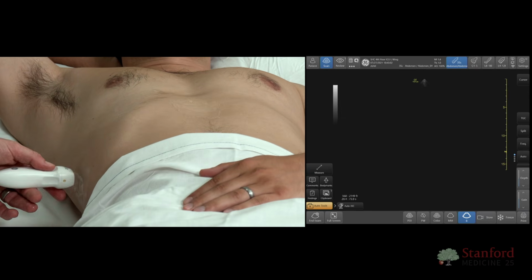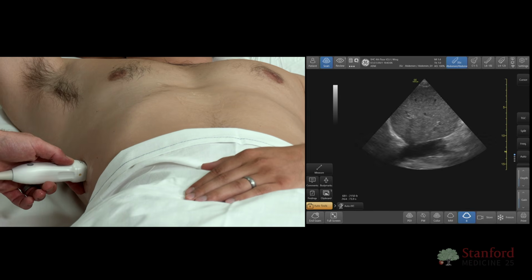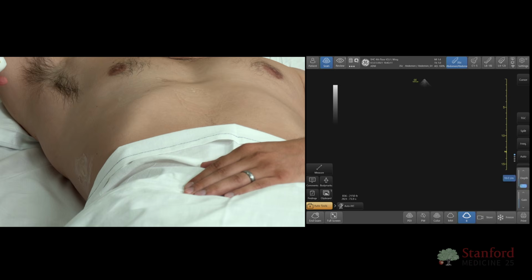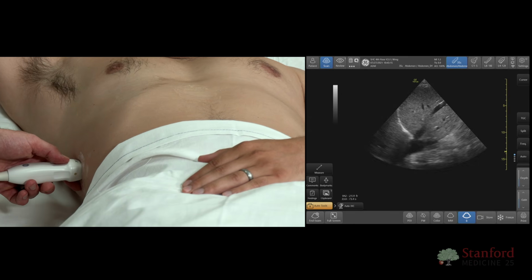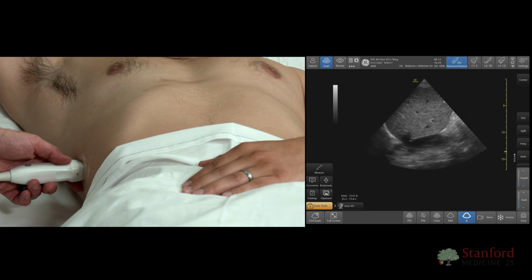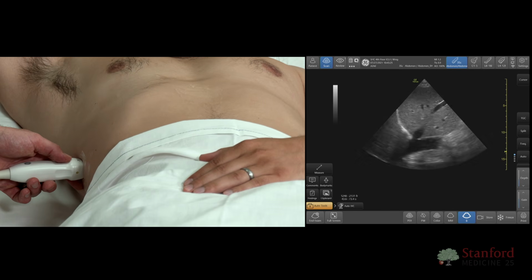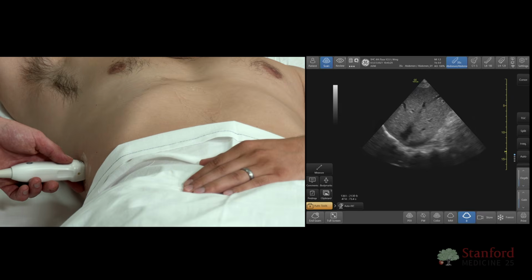Again, I'm going to look for a really pretty picture through the liver, and look at that. You put the probe on there, and the IVC just jumps into place. Okay, it's right at the bottom of the screen. I could give us a little bit more depth if we wanted to, maybe center it just a little bit better. We can see the hepatic vein entering. That's a gorgeous picture. Now, just as we did before, we can take our measurement, or we could have our patient sniff for us, right? And we can see really nice collapsing of the IVC. Okay, we can feel pretty good that his CVP is normal at this point.